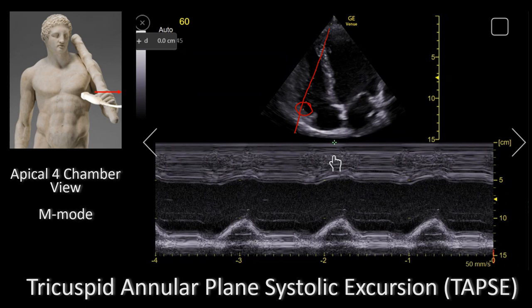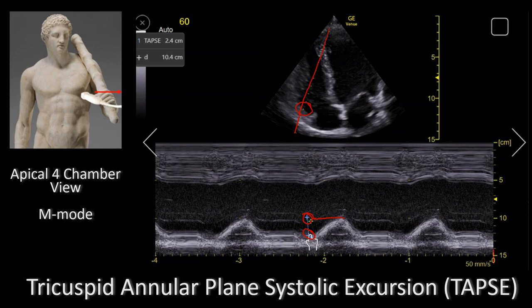You want to measure the amount of longitudinal motion of the annulus at peak systole. You place the cursor at diastole, which is right there, and you measure to the peak of systole, which is right there. What you're really interested in is the distance between systole and diastole.